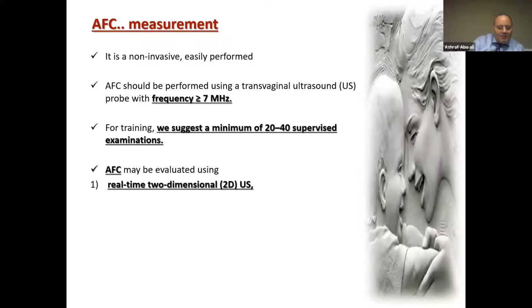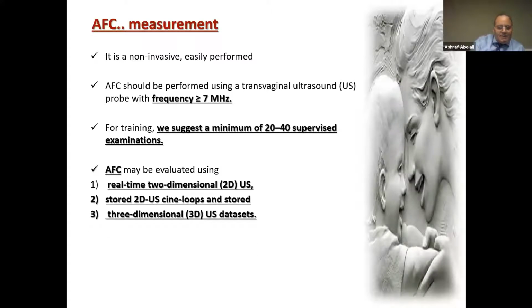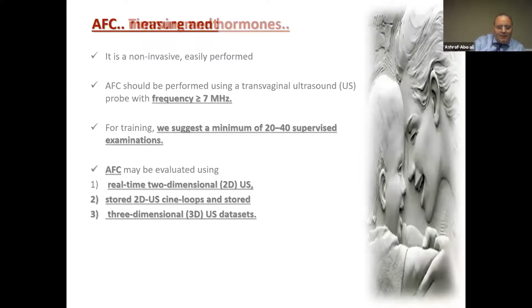Antral follicle count may be evaluated using normal real-time 2D ultrasound or stored 2D cine loops ultrasound, and maybe 3D ultrasound if the facilities are there.